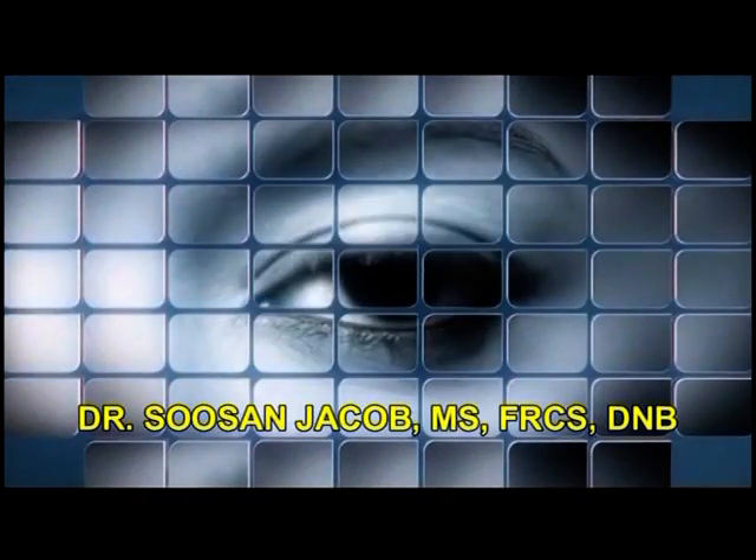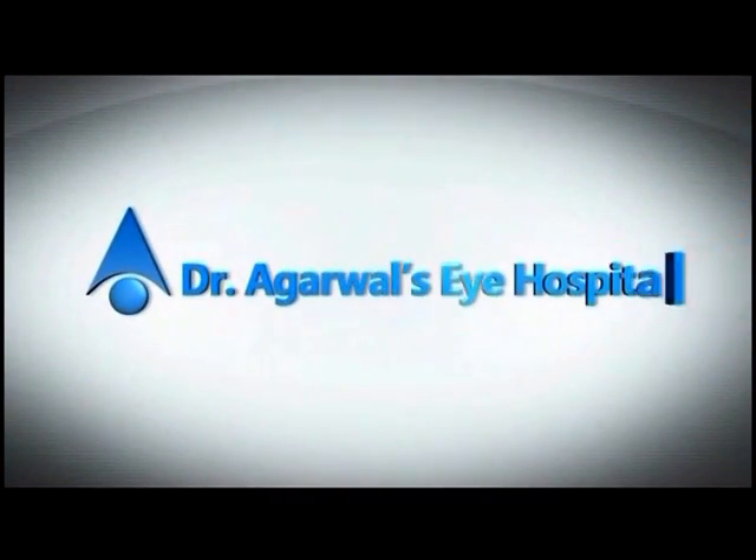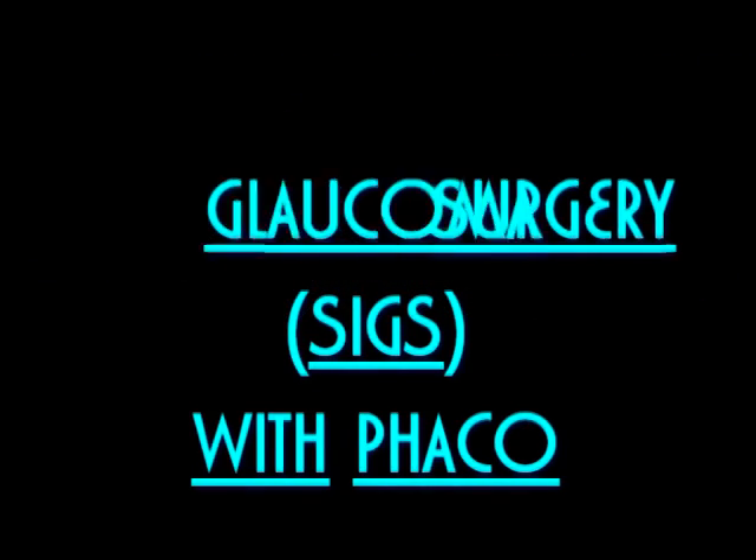Hi, I'm Susan Jacob and I'm going to show you a technique for glaucoma surgery that I've started more than about a year back now, and I've termed it as SIGS — STAB Incision Glaucoma Surgery.